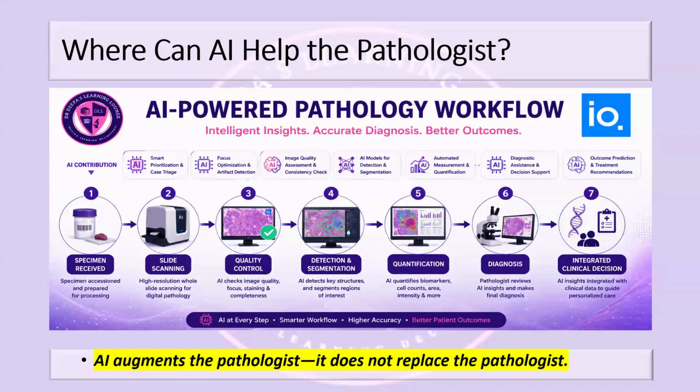But AI provides a quantitative analysis, it highlights areas of concern, it assists in interpretation, it assists in clinical judgment, it gives you a contextual understanding, and it allows the responsibility for diagnosis to continue to rest with the pathologist. So don't even think that AI can replace pathologists. It does not.